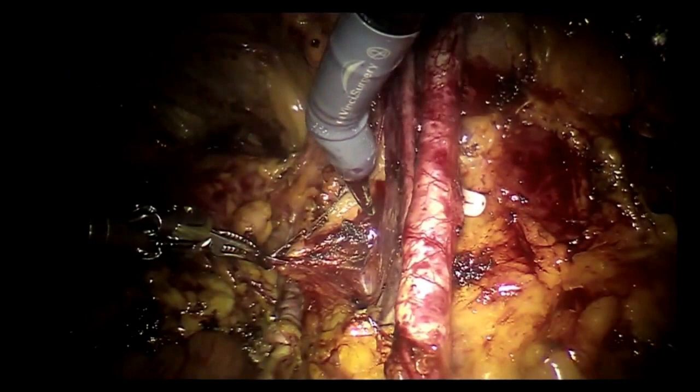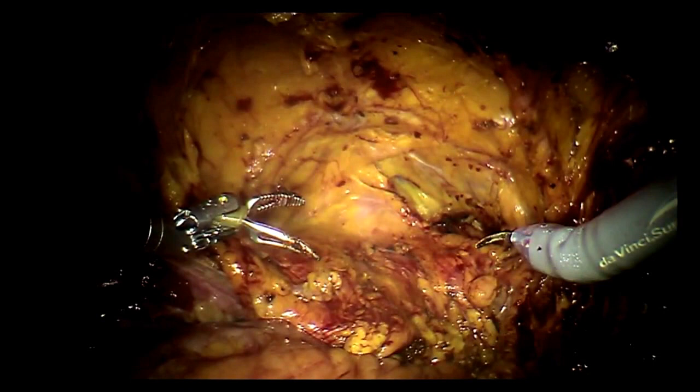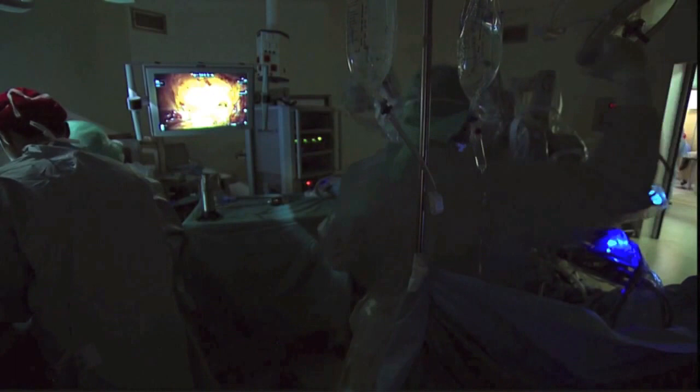Have you ever needed to tie the internal iliac vein in your previous surgeries? No. And if you did so, was it troublesome in robotics? No, we didn't have to do it. That's one of the things. Okay, guys, go ahead. Undock and make the incision. That's one of the things with robotics, at least for this anastomosis. When I was doing it open surgically, absolutely we had to do what you just said. On occasion, we had to take the internal iliac vein and control it and then release the external iliac vein up into the field. Robotically, we can just go in and do it over there. So in the minimal experience we have so far, 12 cases, we've not had to do it.